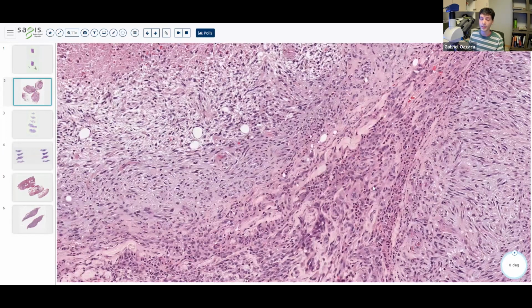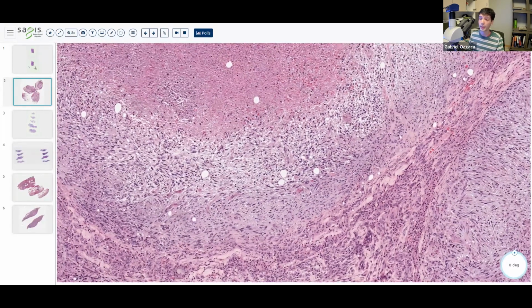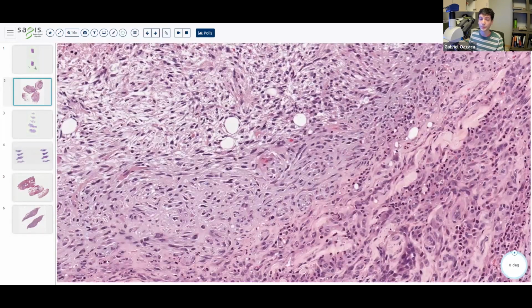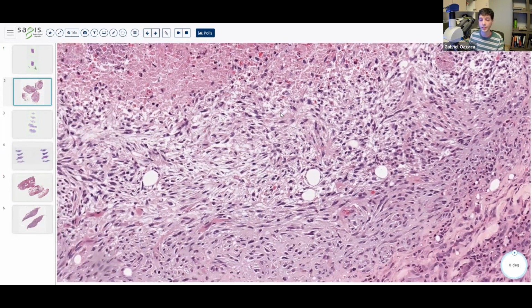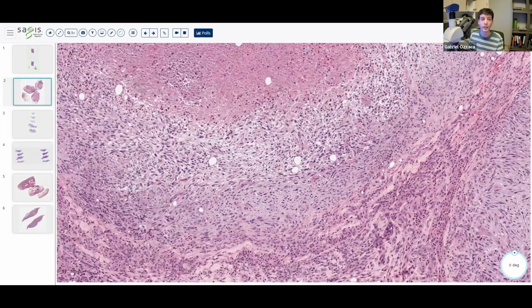There are instances in which an epithelioid sarcoma may be very low grade and not very epithelioid to speak of, and mostly spindled, in which case the differential really does become quite challenging. At that point, immunohistochemical staining is very much so warranted. And in fact, in this case, it should also be performed just to verify the diagnosis.